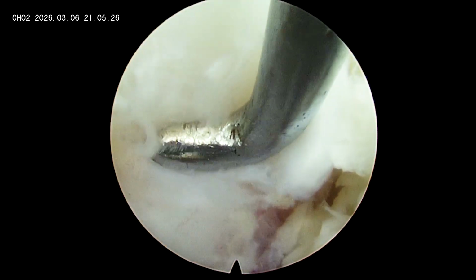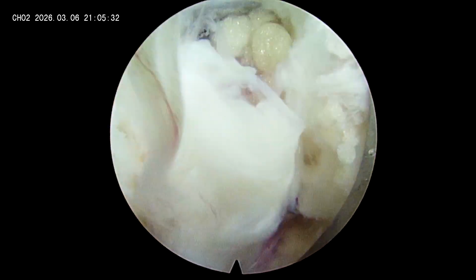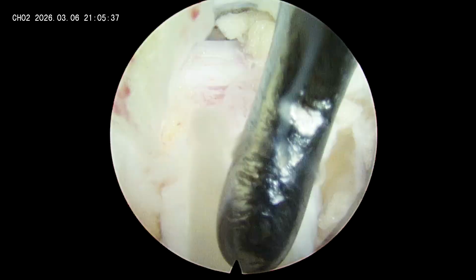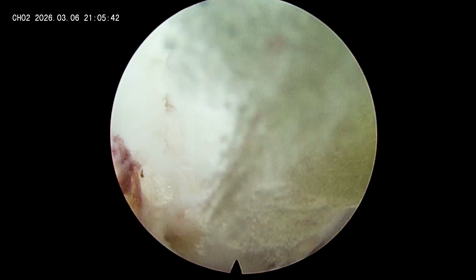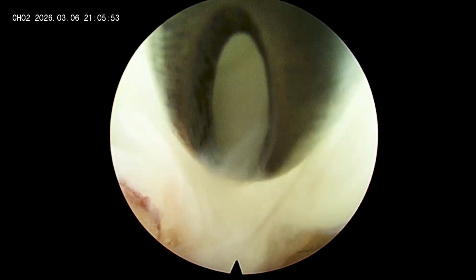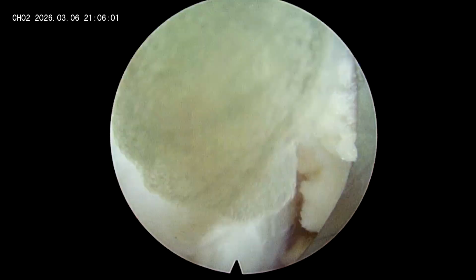It is advisable to tease the disc fragment all around and then start removing it. You can see here the disc fragment is slowly coming; slowly we are separating it from the underlying tissues. This will ensure the complete removal of the fragment. If you separate the disc fragment from all the surrounding adhesions, the chances of removing the disc fragment completely are more. So here I am just removing the disc fragment.